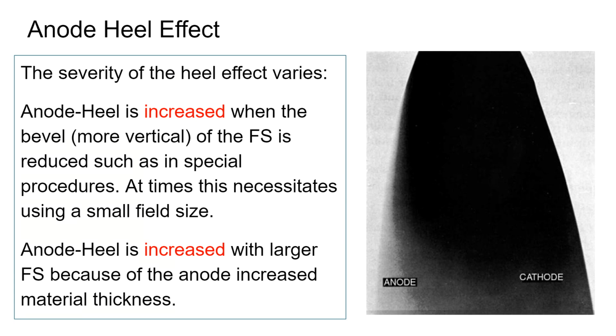So this percentage may change a little bit. I could draw these lines a little bit differently. Again, this is something that you can't change, because whatever anode is in there, you can't change the angle, right?